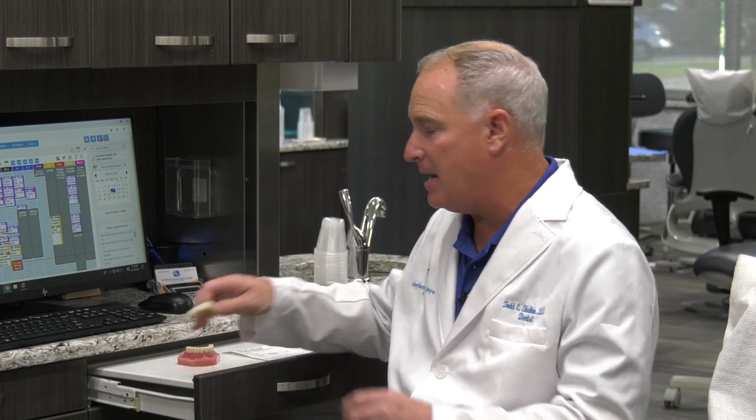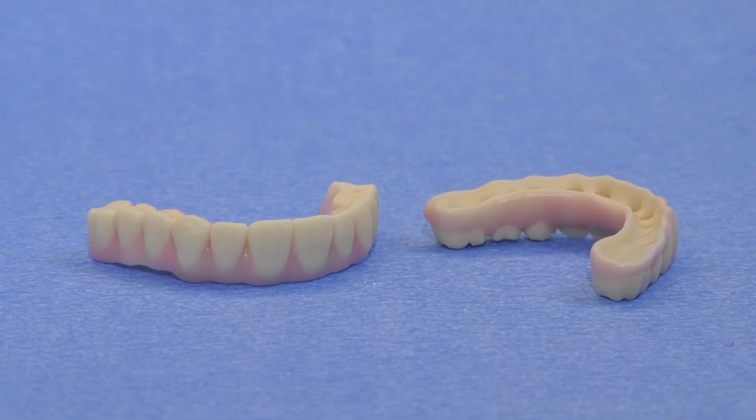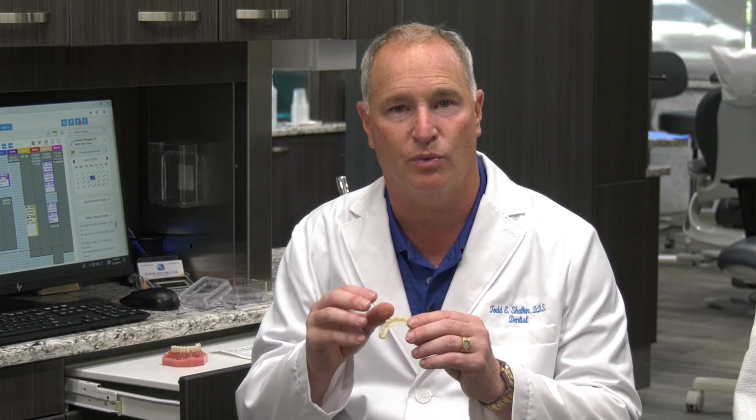We will send you back a nice acrylic milled try-in. You'll try that milled framework in the patient's mouth. It's going to be a milled plastic try-in that you're going to try in, and this is your chance to look at it in the patient's mouth, let the patient take a look at it, see if they're happy with the way it looks. This is not something for them to take home with them. It's just for them to try in the mouth and make sure that the midline is good, the occlusion is good, and the general smile line is good. At that point, if you need to make some adjustments, go right ahead.